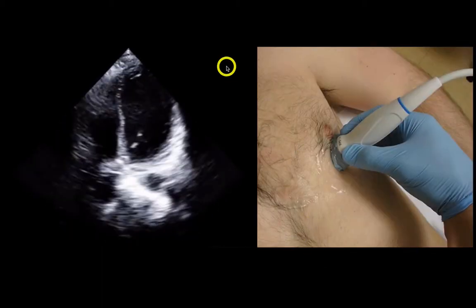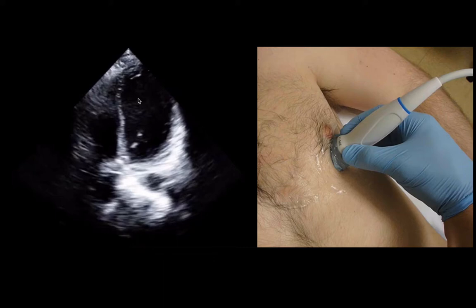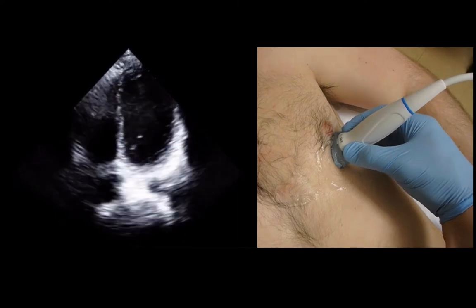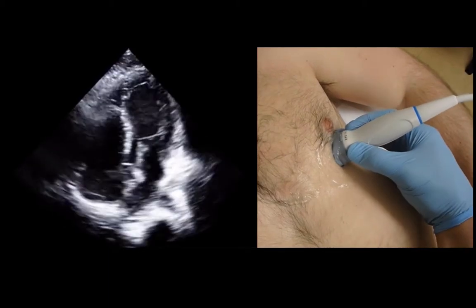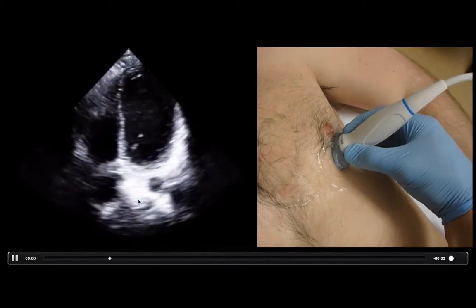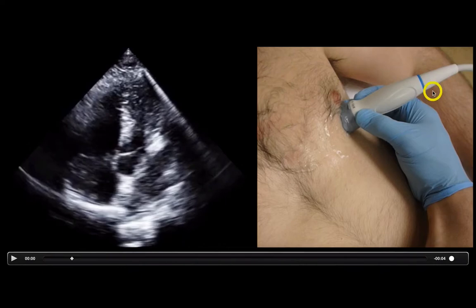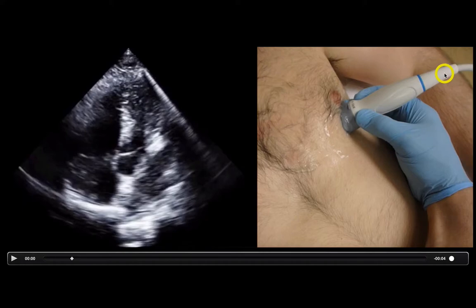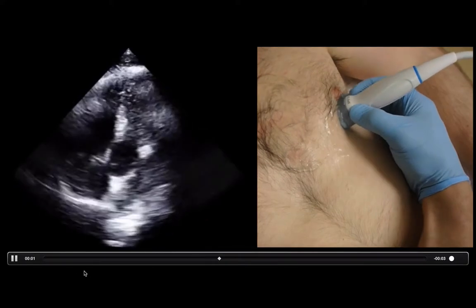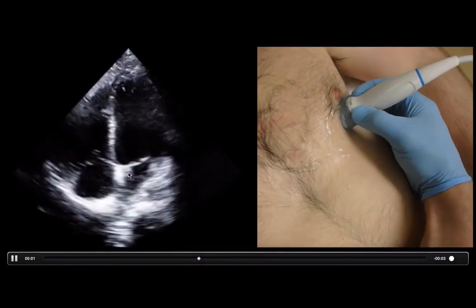You can also angle the probe a little too deep or too superficial. If you angle too deep — tail too far up — you'll get a view of mostly ventricles. To get the classic apical four-chamber view, you need to see all four chambers. If you see mostly ventricles, flatten your tail relative to the patient to bring the beam a little more anterior, and the atria will pop into view. You can also be too superficial — tail too low — and end up with an apical five-chamber view where you see the aortic valve going into the aorta. If you see that, bring your ultrasound beam a little deeper by angling the probe tail a little more superior, and it'll open up into the four-chamber view you want.